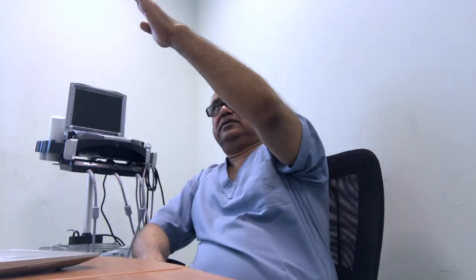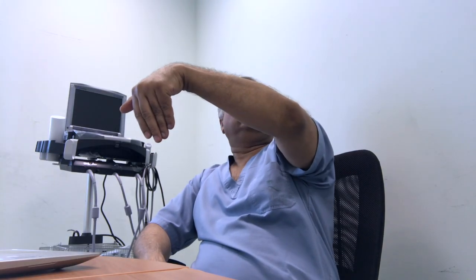Most common relation: median nerve at 11, ulnar at 2-3, and the radial at 6 or 4 to 6 o'clock position.